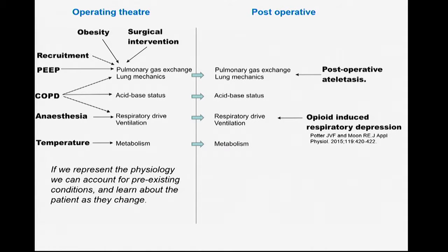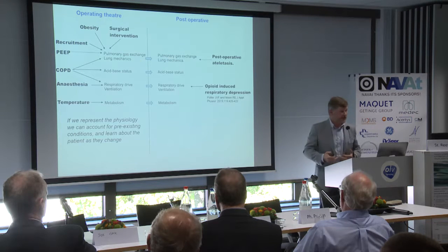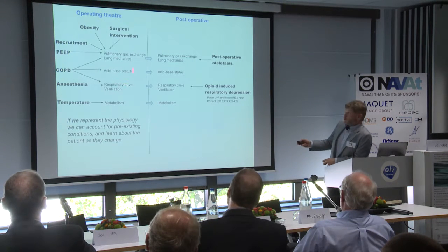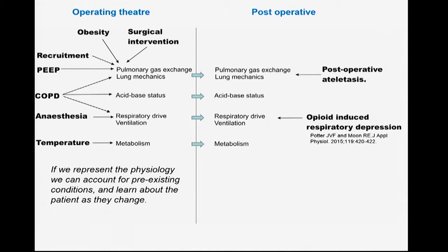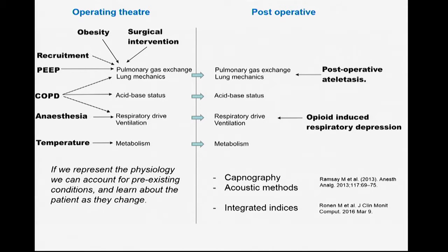As has been pointed out, we want to know what's happening to them post-operatively. We want to know whether the atelectasis persists. And if we could measure pulmonary gas exchange during the surgery and post-operatively, maybe we would get continuity of monitoring. Similar with respiratory drive, we may want to look at it during the phase of waking up from surgery, but then we're also interested post-operatively, particularly now with the evidence for opioid-induced respiratory drive depression. So, if we have physiological representation, maybe we can get some continuity of care over the whole procedure.